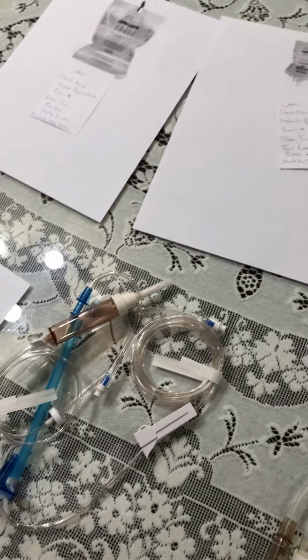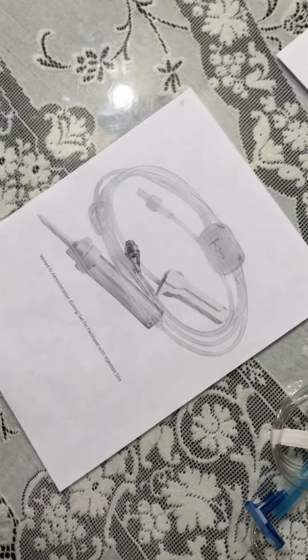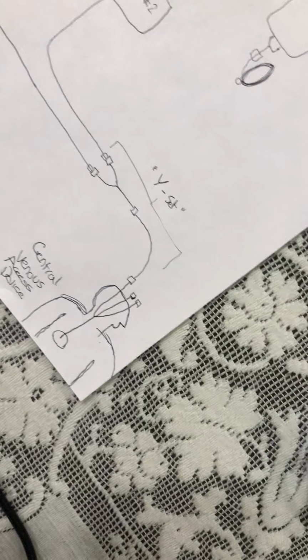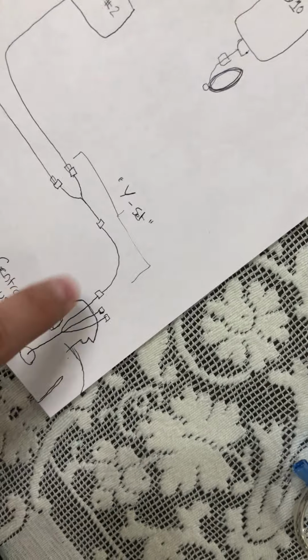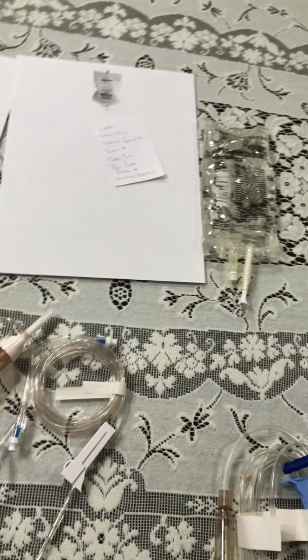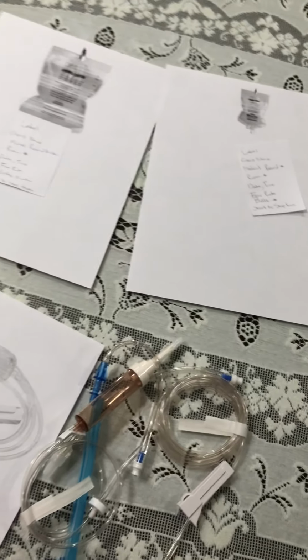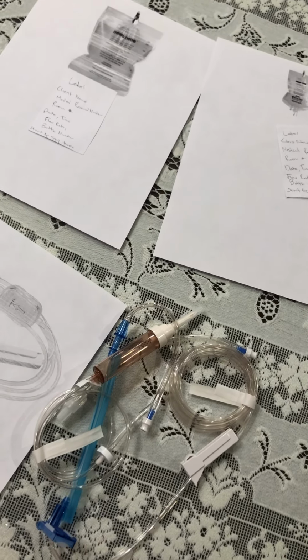I also want to make sure I'm not doing any blood drawing samples or infusing any other fluids with my TPN line. I just want to make sure I'm not again drawing blood samples from my central venous access with my designated line that's getting the TPN. I also want to assess for any complications with TPN administration. Again, this is using a central access device, so complications are going to be severe.